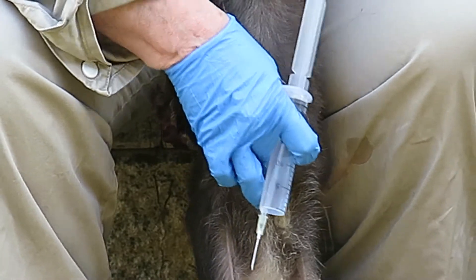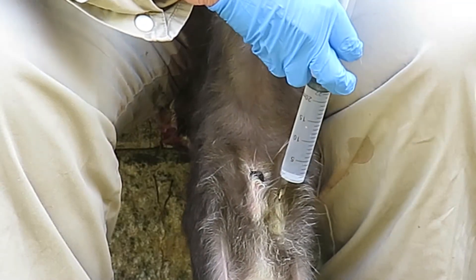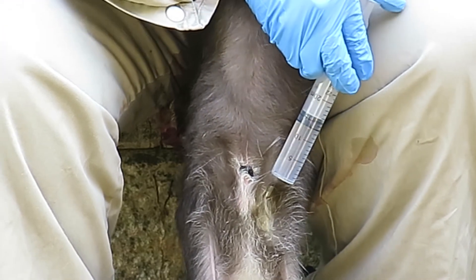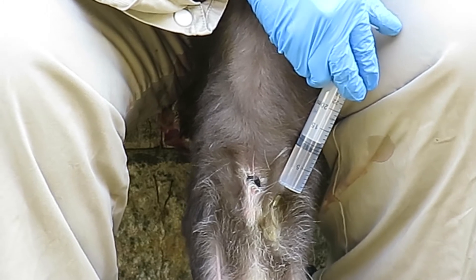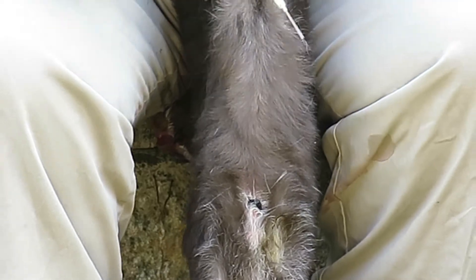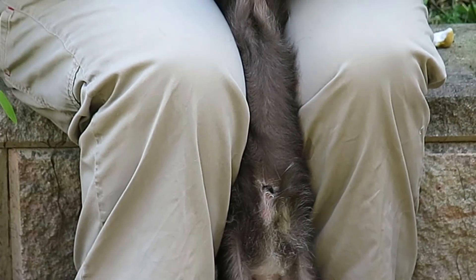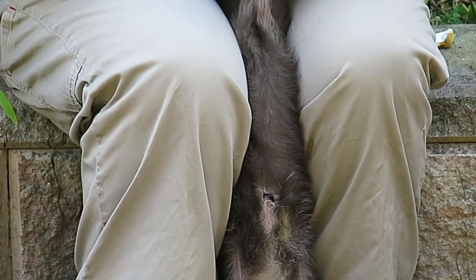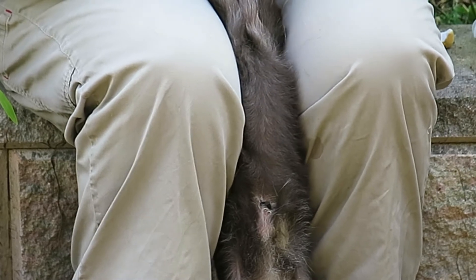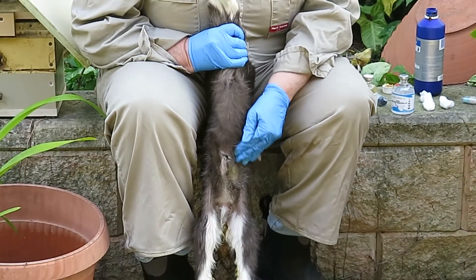Even less for a miniature breed. Aim towards the rump, then insert the diluted glucose solution. All the contents of the abdomen have fallen down, so it's quite a safe procedure. Once the glucose has been given it is safe to warm up the kid. If you warm the kid up before giving the glucose, the kid will go into convulsions and die.